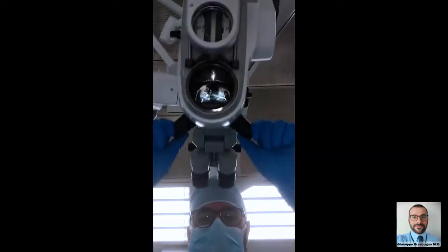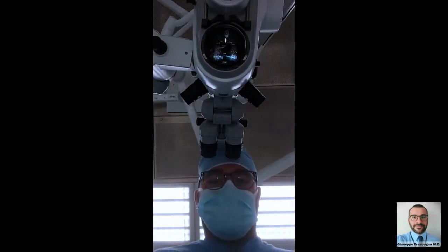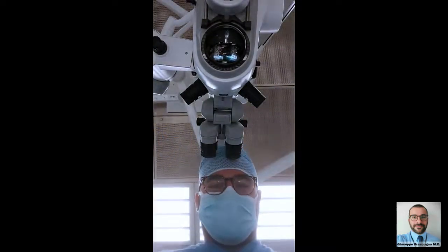These are the main settings of a surgical ophthalmic microscope. Thank you for your attention.